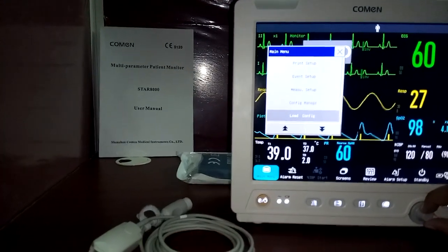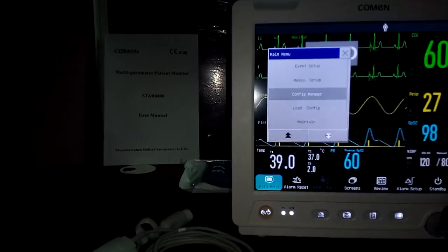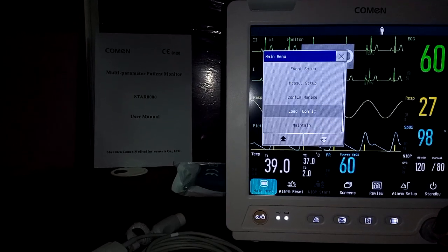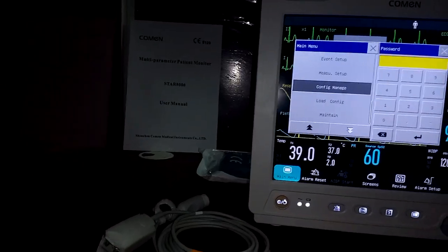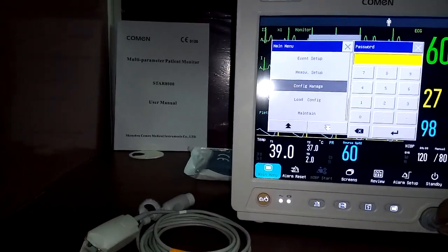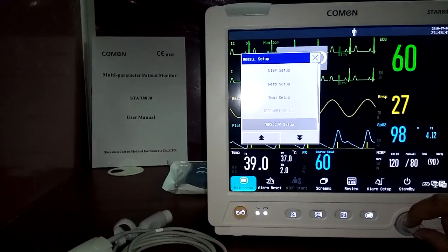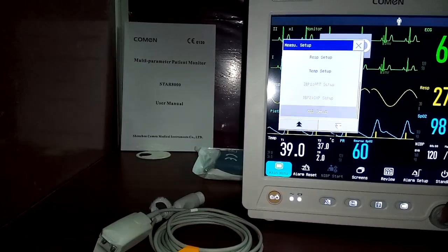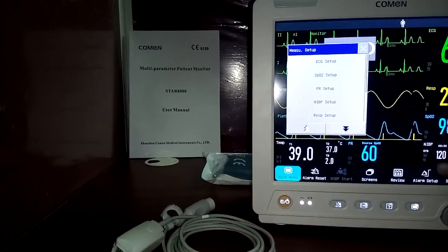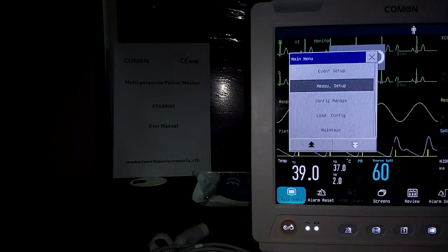In the main menu, you also have load configuration and maintenance. The biomedical engineer can perform all system-level settings in the maintenance area. Under configuration, measurement settings include temperature, invasive pressure (ART, CVP), and CO2 settings — ETCO2 is an optional parameter on this monitor.